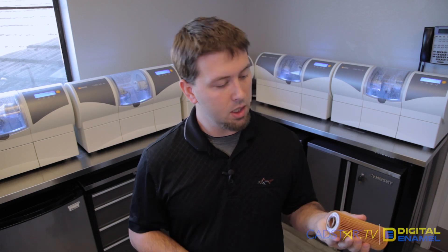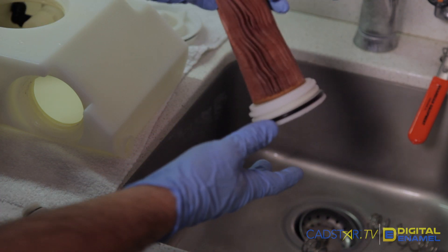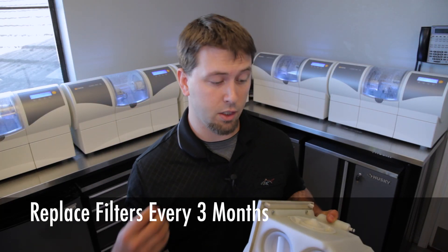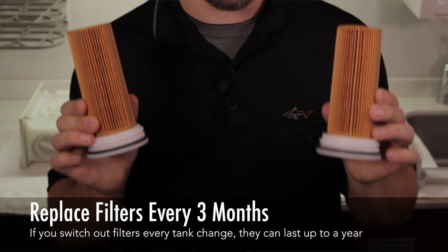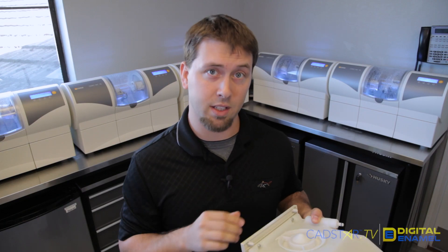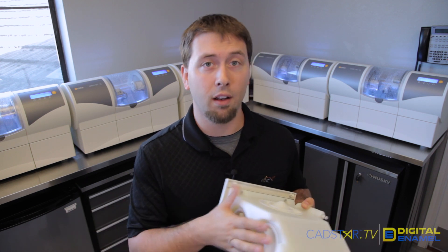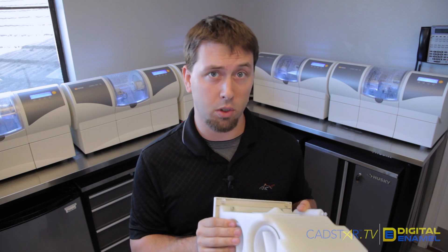When you're done, make sure the labels are pointing out and put the filter right back on. Also make sure the spring is in there when you put it back together. Ideally, you have extra filters to swap out. Sirona recommends replacing the filters every three months, but techs say they can last up to a year if you continually switch them out every time you clean the tank.